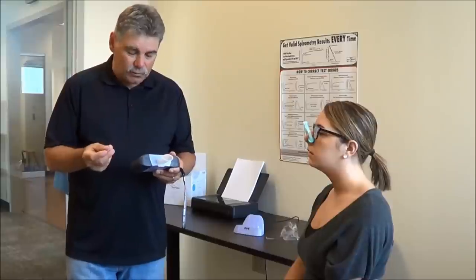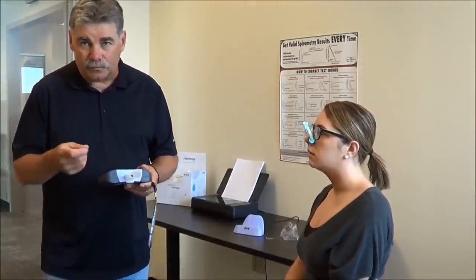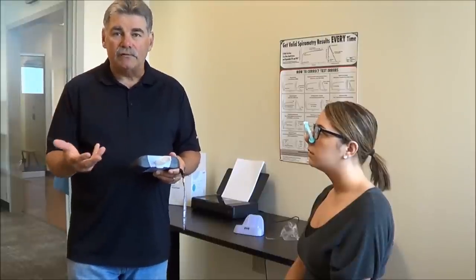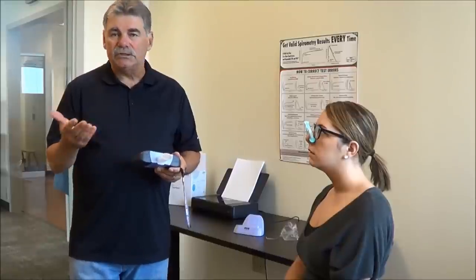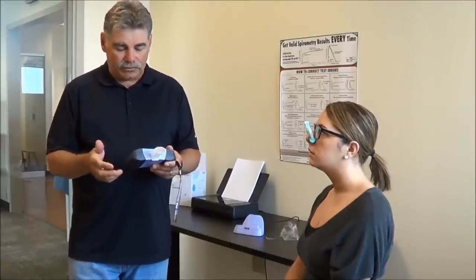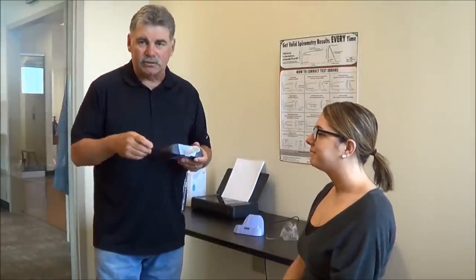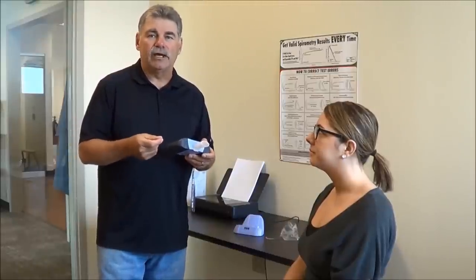acceptable trials where the reproducibility is actually better than 100 milliliters for an A, and 150 would have been a B. B would be good enough. C is good in a pinch. We really would like an A or a B. Now, you can do up to 8 trials to get to this point. In this case, Tina is a very good student, and she understands how to do the test, so it was quite easy for me to get a good grade after 3 blows.